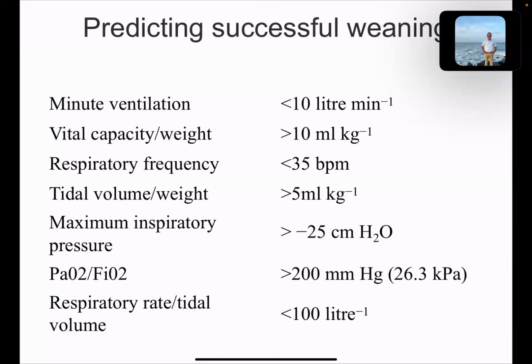So when you are seeing any patient who is on a ventilator, you can go and assess how much FiO2 is running. If you see FiO2 at 60%, 80%, definitely you would say that these patients still require ventilation. It is not easy to wean off now. If the patient is maintaining his saturation and FiO2 is 20 to 30%, then you can say straight away that in the next 2 to 3 days, he will be extubated. That's why the PaO2 to FiO2 ratio is very important.